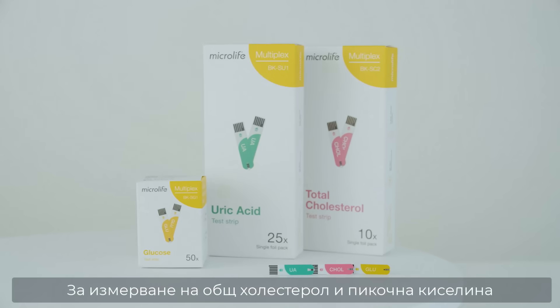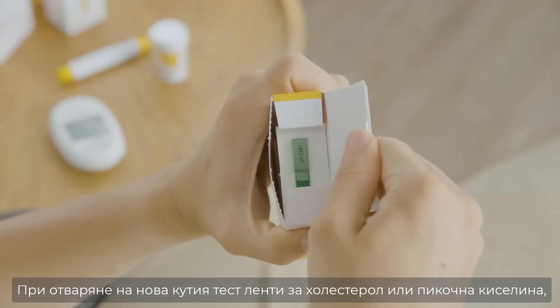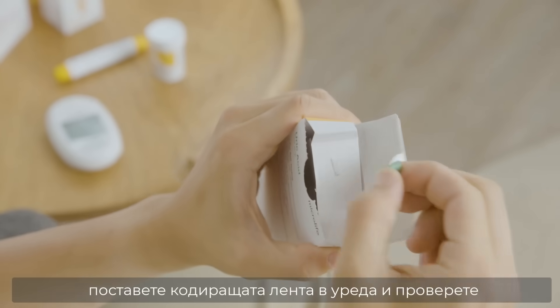For the total cholesterol and uric acid tests, you will need a coding strip for each test as well as separate foil-packed strips for total cholesterol and uric acid. When opening a new box of total cholesterol or uric acid strips, perform coding first.